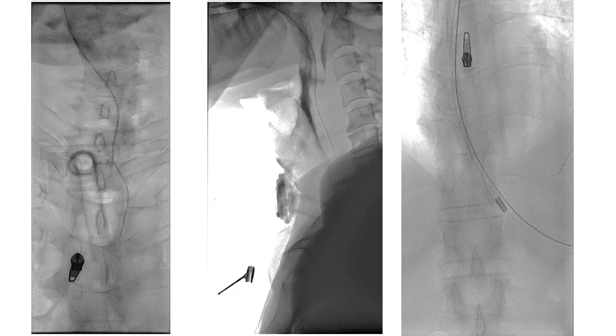Note the guide wire going as far down as T4-5 level. The middle panel shows the true entry into the esophagus. Subsequently, an NGT was inserted after exchange of the hydrophilic guide wire with an Amplatz extra stiff guide wire.